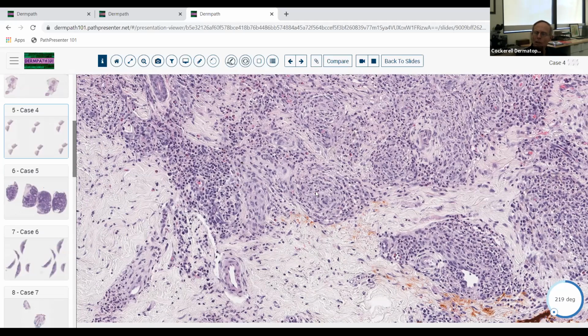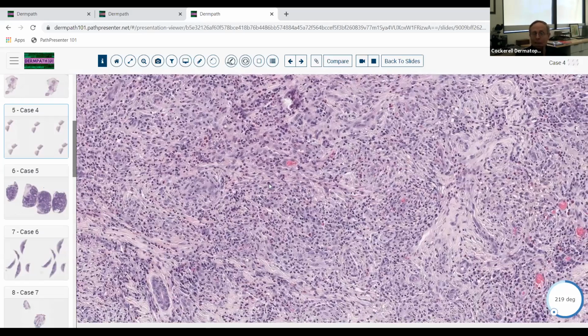We see these lesions clinically. That's one of the reasons that in the future we'll probably be putting some clinical slides in here also. You'll see this brownish peau d'orange appearance on the face. And they really get that peau d'orange morphology. The pre-existing adnexal structures are preserved. They're not destroyed, but they become patulous. And that's a very characteristic feature of this disease. And you don't really see that in a pseudolymphoma.